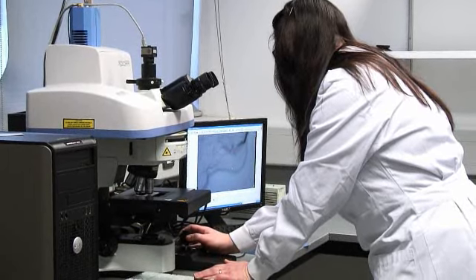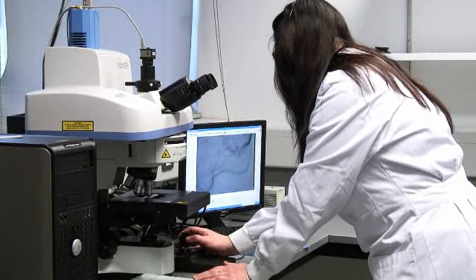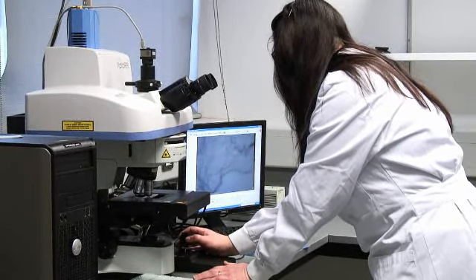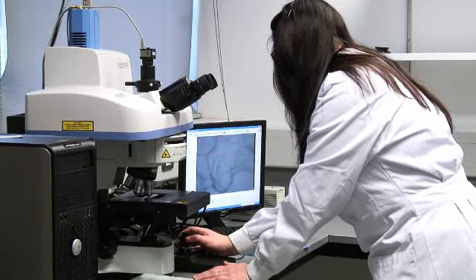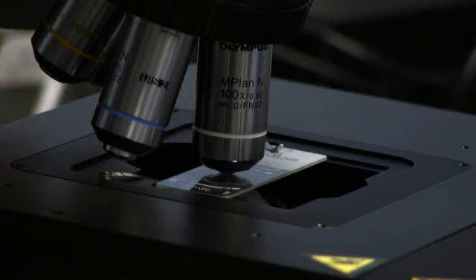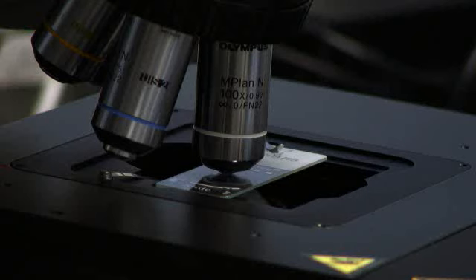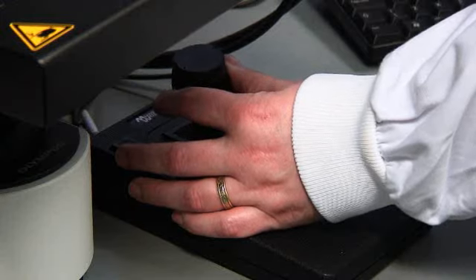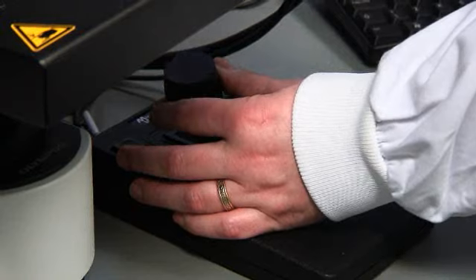It uses a standard microscope that's used in typical hospital laboratories. Basically what happens is a laser shines down onto the sample, which would be a cervical smear sample or a cervical tissue sample.